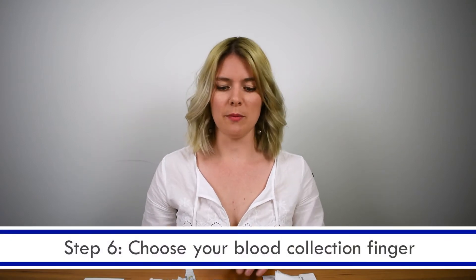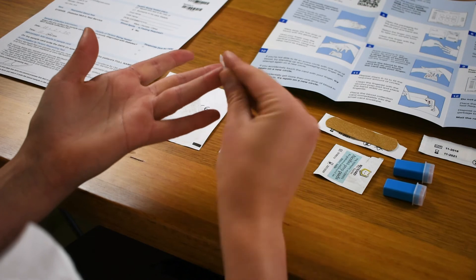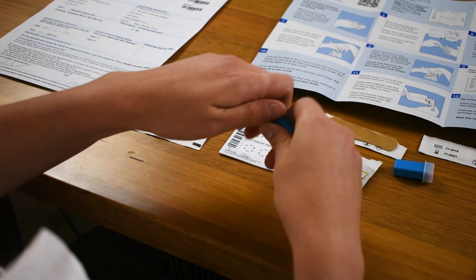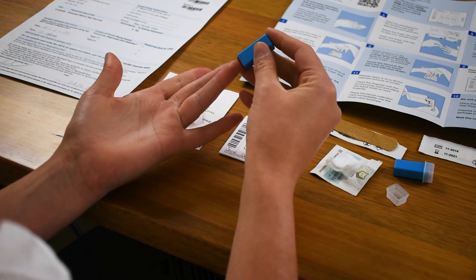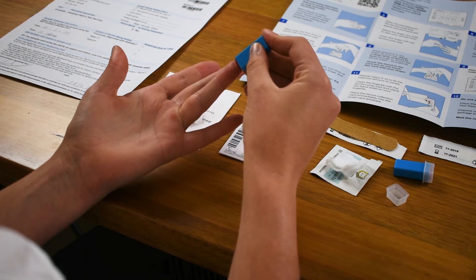Step six: make sure that you've got your blood collection card in front of you and choose the finger you're going to collect your sample from. The best sample is often collected from the ring finger or the middle finger, and where you want to prick is just at the tip, slightly off center. Step seven: pick up your alcohol wipe and clean the end of your finger. Pick up the lancet, remove the cap and position it onto your finger — just on the end and slightly off center — and when you're ready, gently push down until the lancet activates.